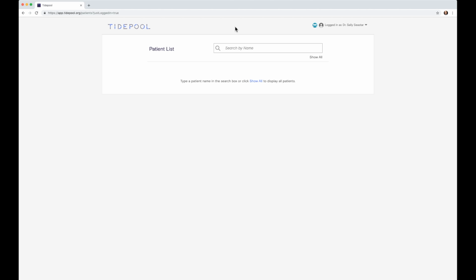Second, I've currently logged into Tidepool Web with Dr. Sally Seastar, our demo clinician account, so this is everything you will see whenever you log in to Tidepool Web with your clinician account. However, after this patient list screen, everything else you're about to see in terms of the data presentation is exactly what your patients would see whenever they review their Tidepool data at home. We do not differentiate data visualization between patients and providers.